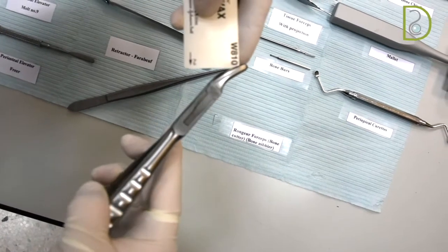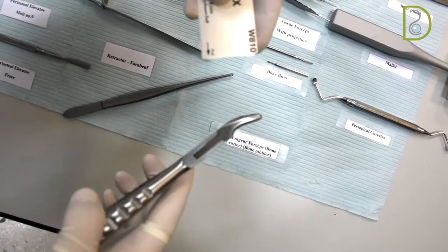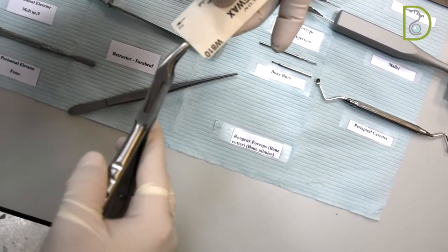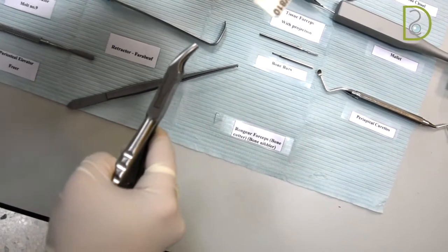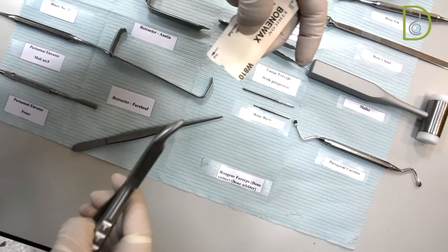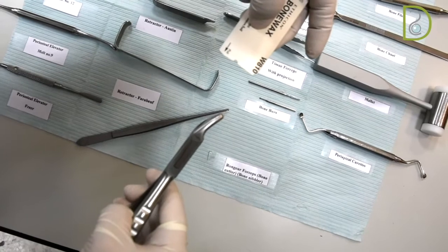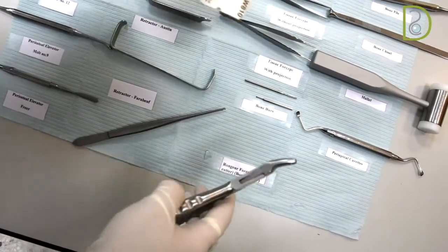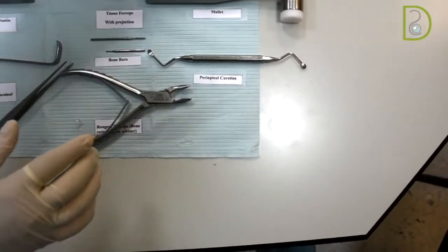Again, I will show you. You will press and pull away. That's how you will use it. For the inside, you will bring the tip of the rongeur and you will cut, and that's how you'll cut it and take it away. No rotational movement whatsoever, or you will harm the bone and chip it in an undesired manner. This is the rongeur.